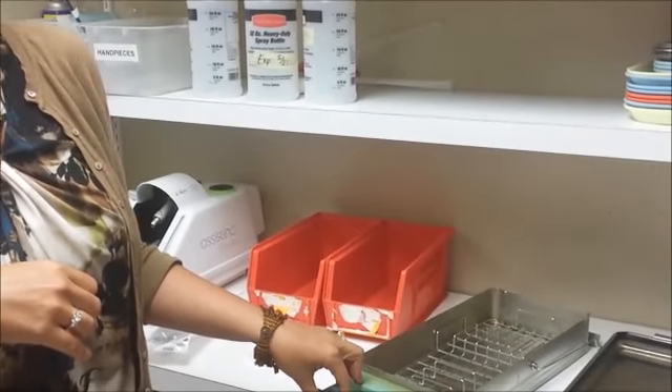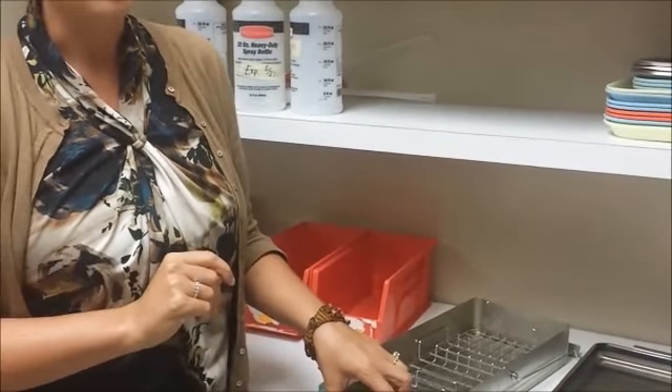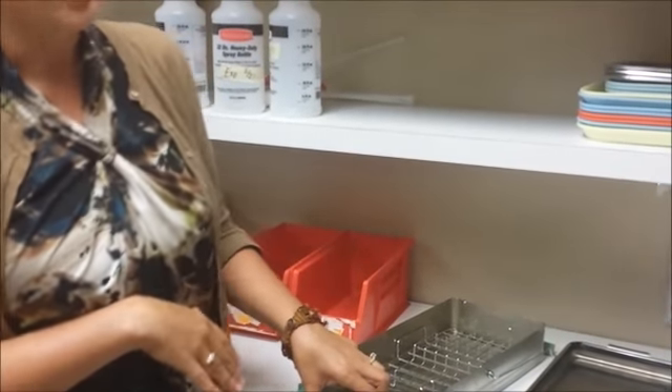Regarding the dry cycle: once you have run the cycle, the instruments should be completely dry. Once they have run through that dry cycle and are completely dry, they can be put away in the bins.